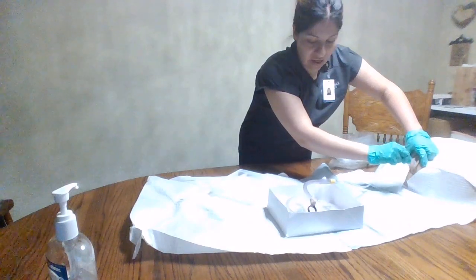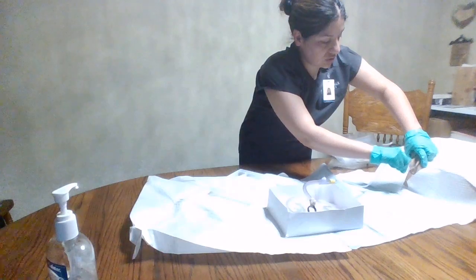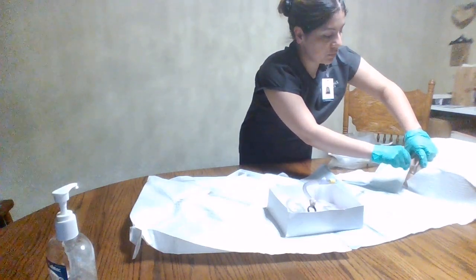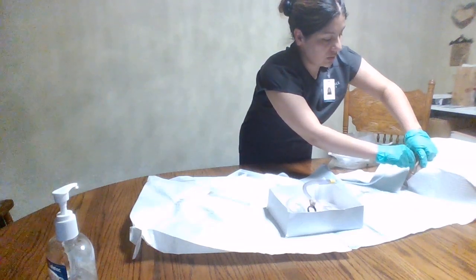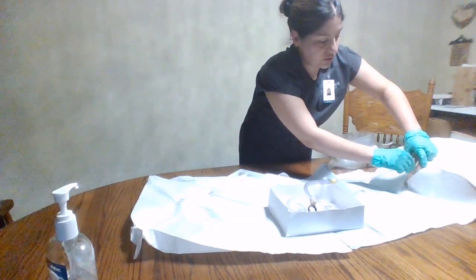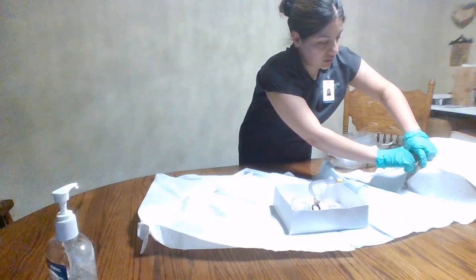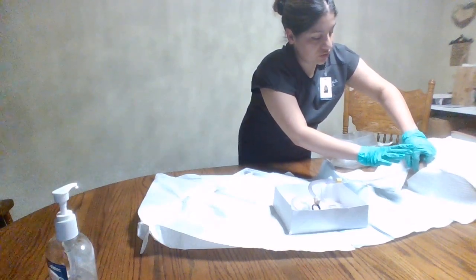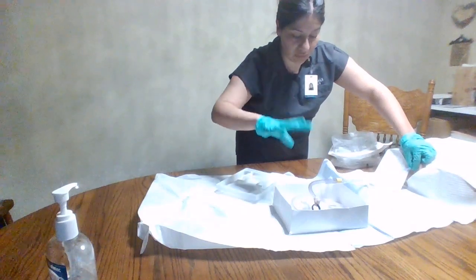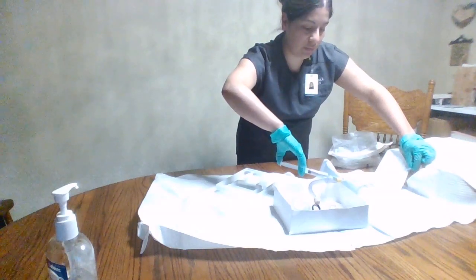Once I do see a flash of urine, I will make sure to insert the catheter an additional 2 inches, which is 5 centimeters. All right, so I have seen a flash of urine, so I will insert about 2 more inches. I will grasp the catheter with my non-dominant hand, and with my dominant hand, I will grab the syringe and inflate the balloon.